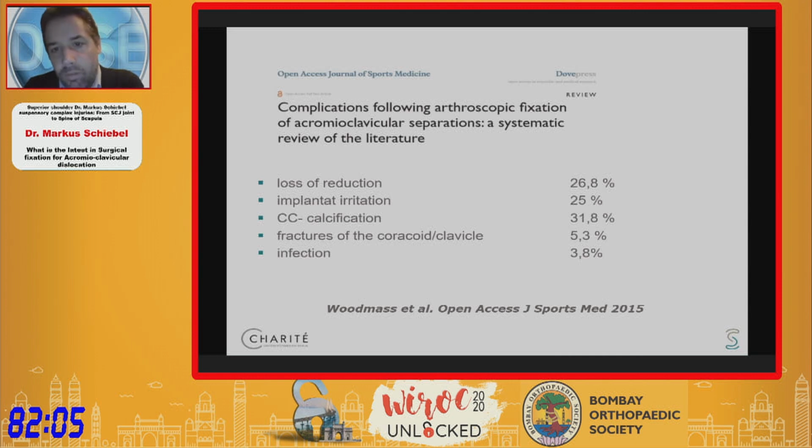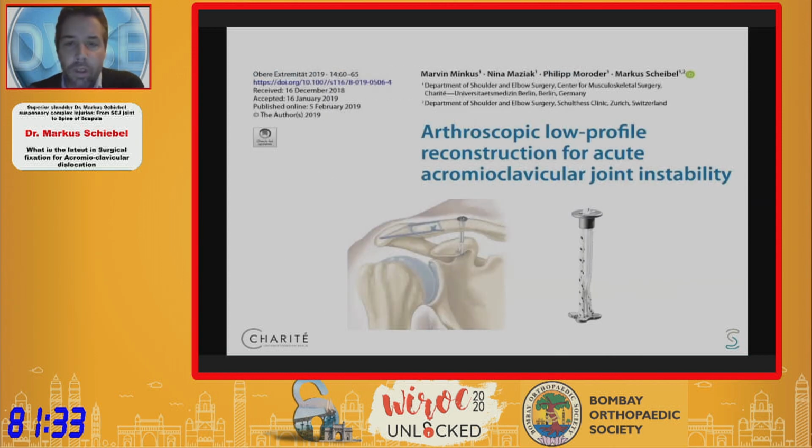And this should not be the case, since these implants are designed for a single operation, compared, for example, to the hook plate. Calcification, I don't think that's a true complication, but of course, fractures of the clavicle or the coracoid, if you have 2 drill holes, can be a problem. So the goal in the future needs to be to reduce these potential complications and obviously keep the good results that we achieved with the current fixation techniques.